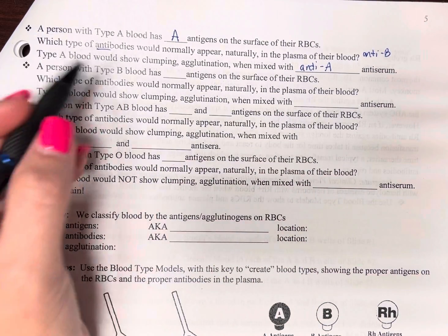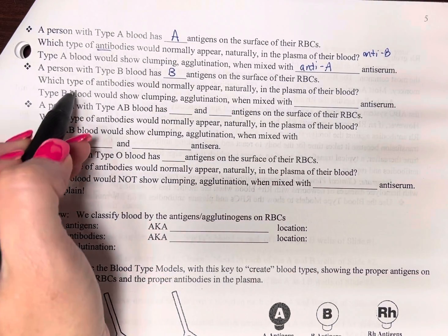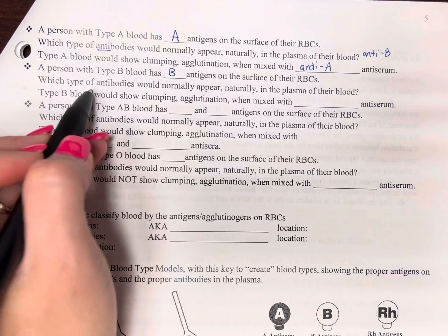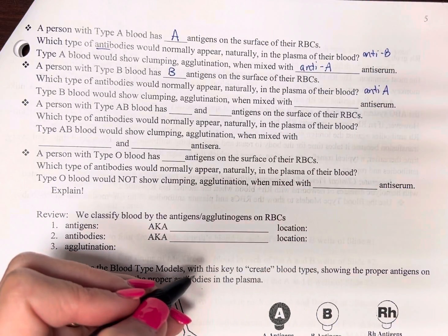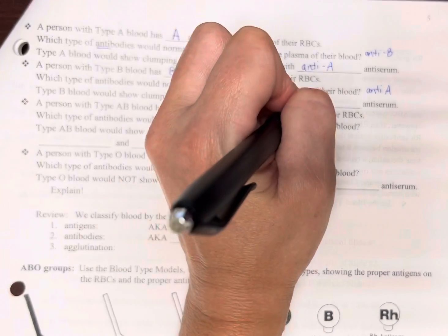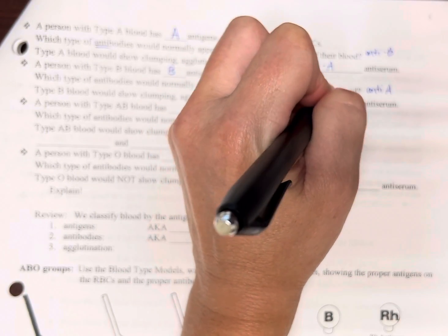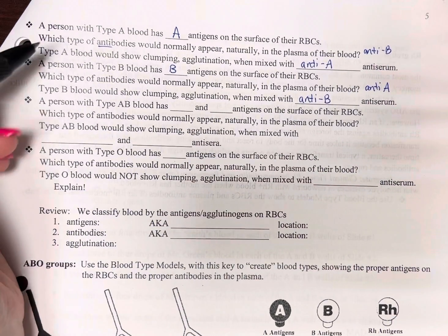Somebody with type B blood has B antigens on their surface. Their body is naturally going to produce anti-A. So type B blood is going to react with anti-B antiserum in a test.